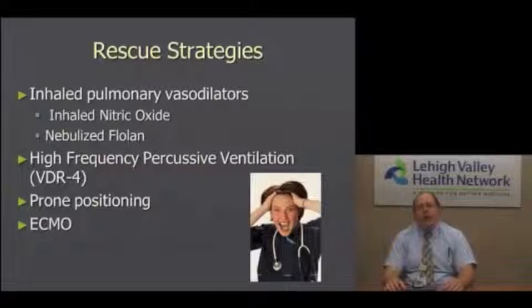High-frequency percussive ventilation is a type of ventilation where we use a percussive rate along with a time cycle rate, which can help stent the airways and allow gas to go in and out, and also can help mobilize secretions.